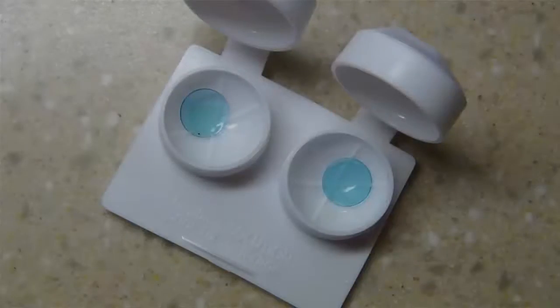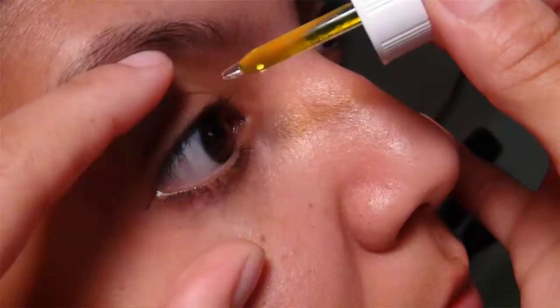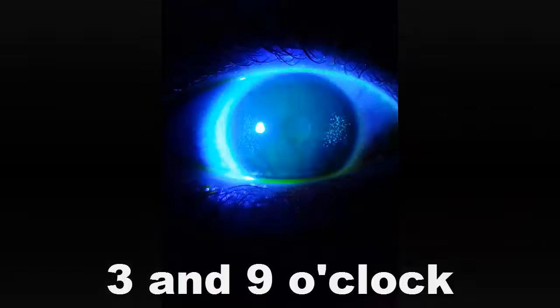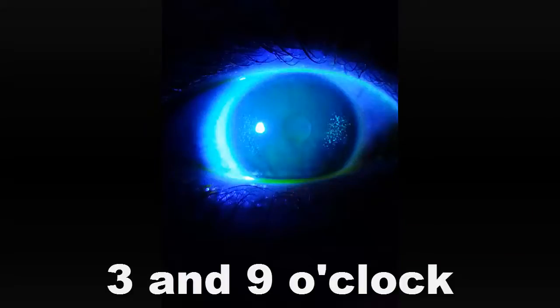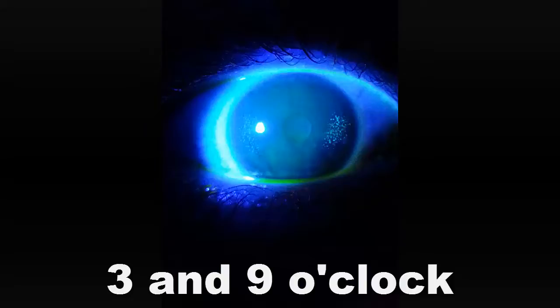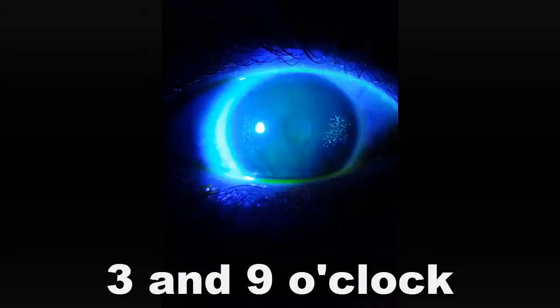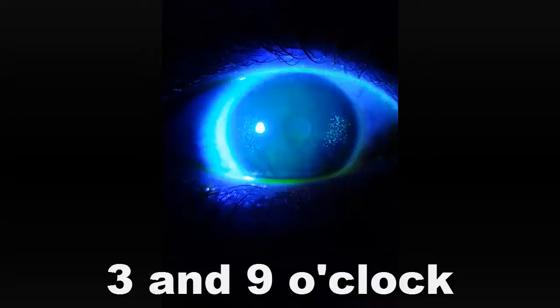So they take the lens out, you drop fluorescein in the eye, and you see this. We call this 3 and 9 o'clock staining. Why does this happen? Simply put, the cornea is drying out. Whether it's because of a poor lens periphery, diameter, or lens material, the underlying idea has to do with an inadequate tear film.